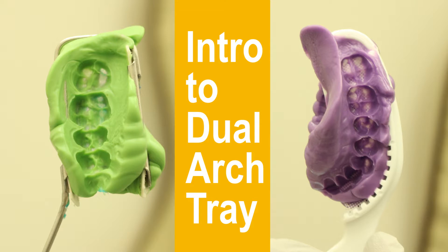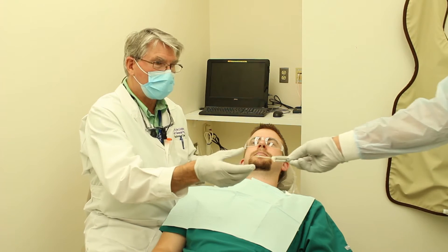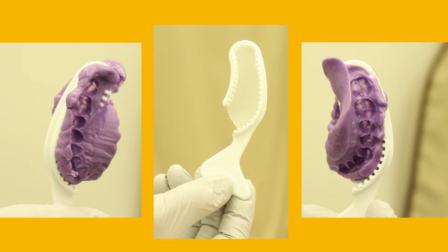This is an introduction to using the dual arch tray, commonly called the triple tray. Here at the school we use a metal dual arch tray because it's considered more rigid and less likely to have distortions. There's also a plastic triple tray, and we're using that for provisional crowns.